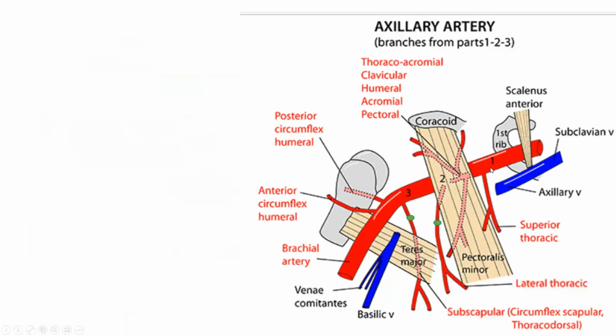Now, why do we want to avoid A1? Because in A1, it's very close to the subclavian artery, so you may end up accidentally sticking the subclavian artery and being inside the chest. Two, A1 has more overlap of the vein and the artery. Like I said, the more distal you go, the more you set apart the artery and the vein. Three, when you access A1, you have a sharp bend past it into the vertical portion of the subclavian artery. So you have more risk of kinks in the sheath.